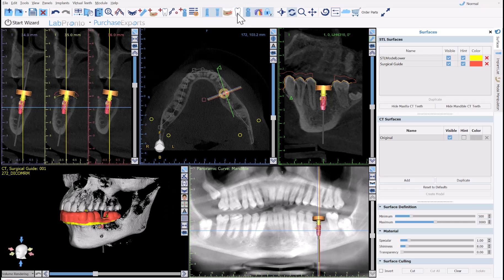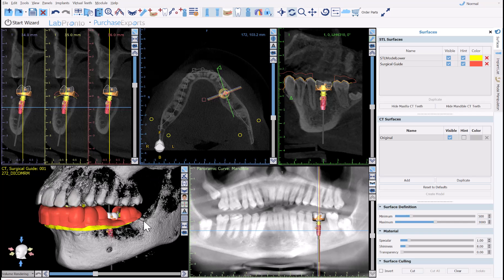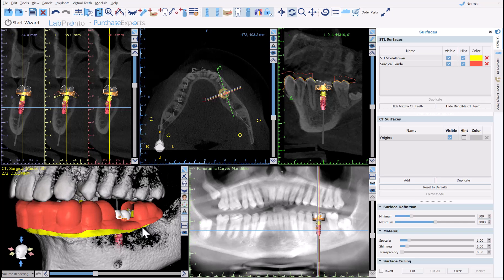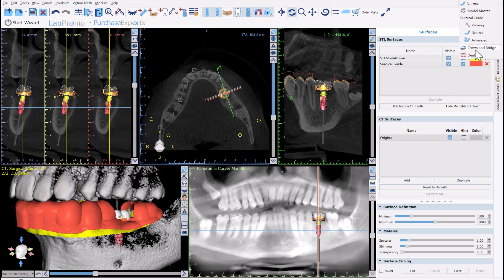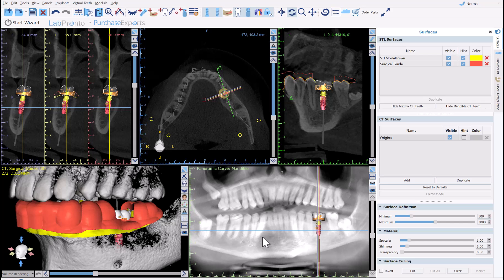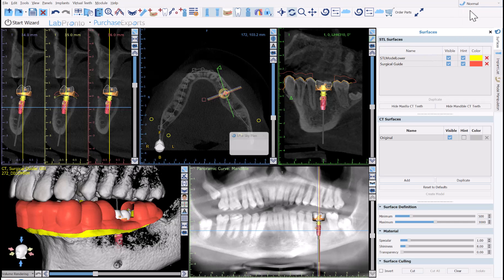Keep in mind that we can toggle on and off the tooth that the software created for us previously. Turning this tooth into a crown for a titanium base abutment can be done with a few simple clicks — we'll have a separate tutorial on that, but you can switch over to the Crown and Bridge software. In addition, if you'd like to automatically segment all the CT teeth and jaws with a single click — for patient education, demonstration, or to confirm and validate implant placement — it can be done simply by going to the Model Master module.